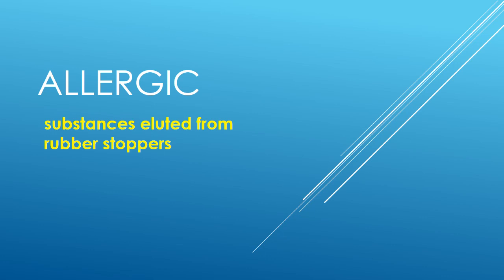There is another important causative factor for allergic reaction. That is the rubber stopper of the bottle which contains IV contrast. I have seen at multiple centers that people tend to poke the rubber stopper multiple times so as to get a free flow of contrast.